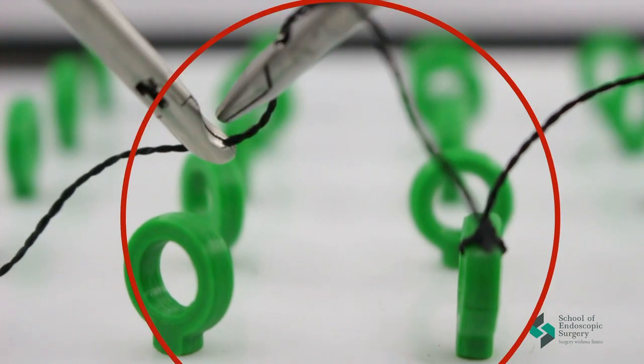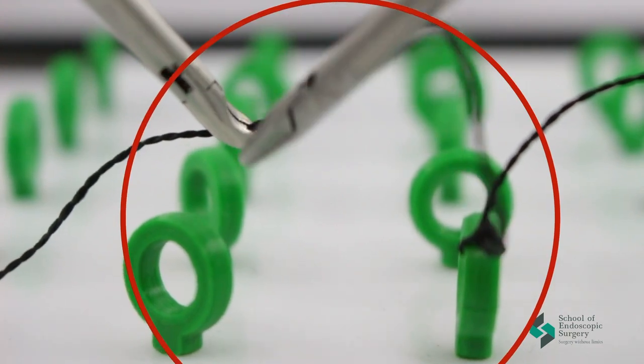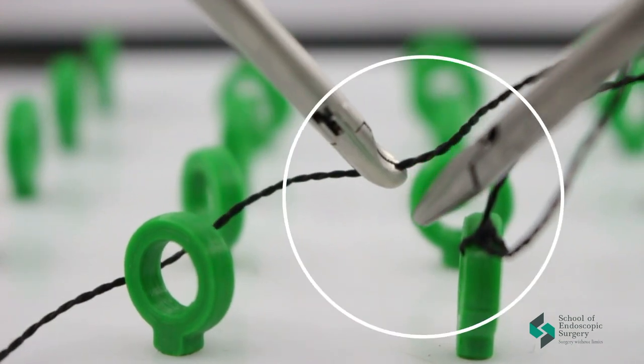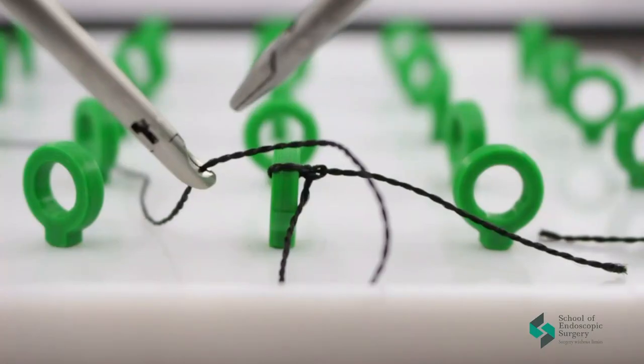The next mistake is forming a knot far away from the center. And don't forget about the dominant hand and always work with both instruments.